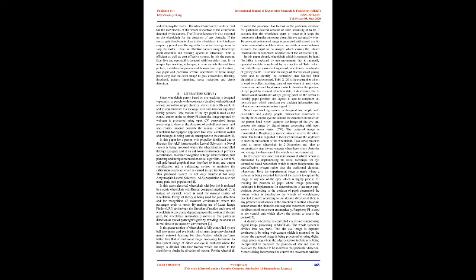This proposed system is beneficial not only for the amyotrophic lateral sclerosis, ALS, population but also for many paralyzed people too. In this paper, the electric wheelchair with joystick is replaced by an electric wheelchair with a human computer interface, HCI, instead of the joystick which is used for manual control of the wheelchair.